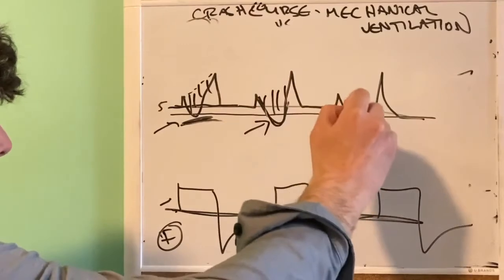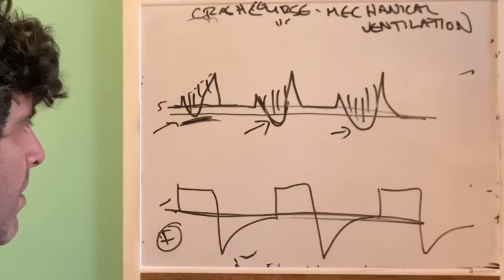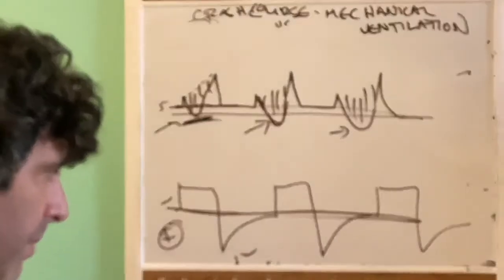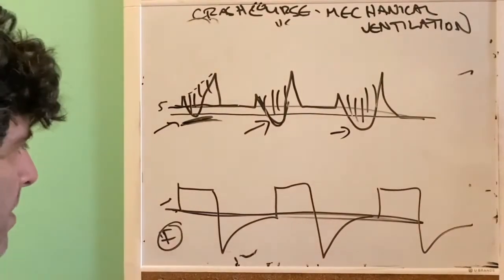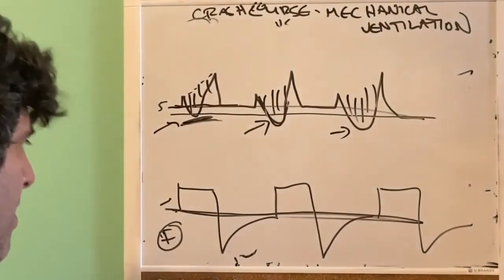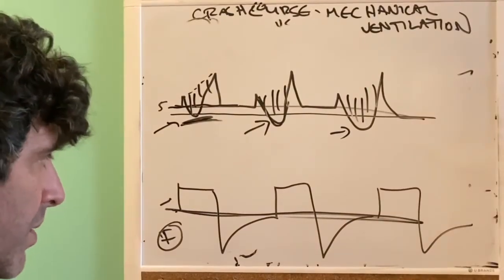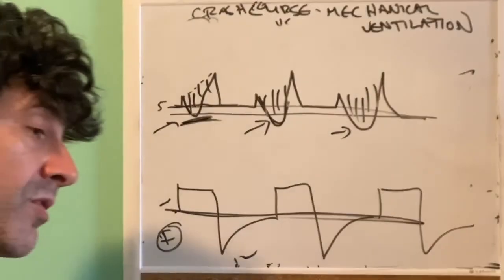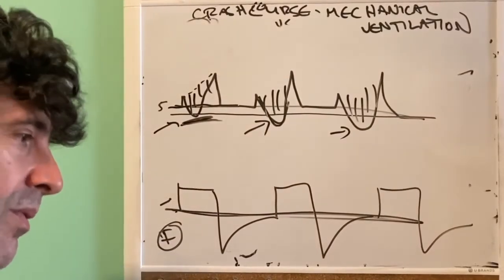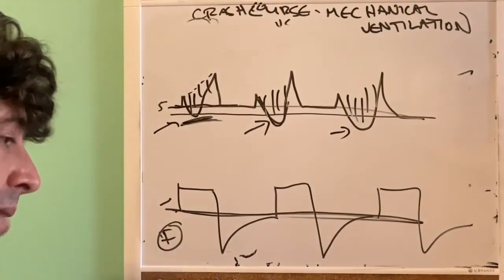And probably this patient, when you look at them, doesn't look too happy. So really, it takes time, and you really have to spend some time at the bedside looking at the patient, looking at your waveforms, and trying to figure out the interaction between what's going on. Because in the next section we'll talk about our priorities and how to manipulate that interaction to what we want to achieve. Just a little primer of that.